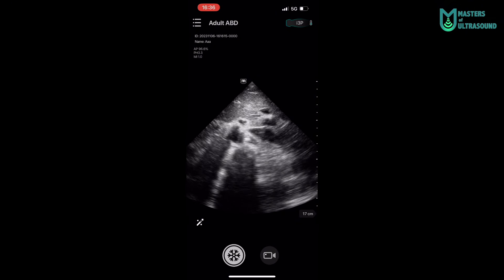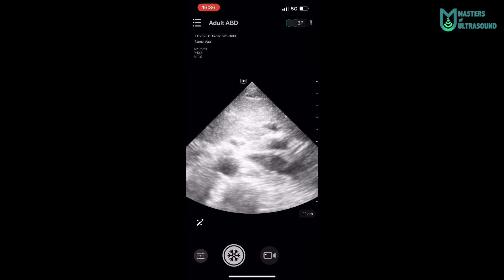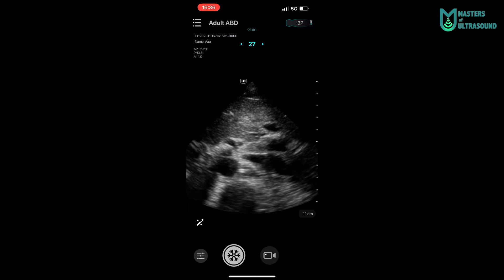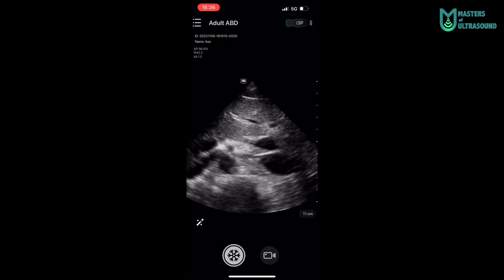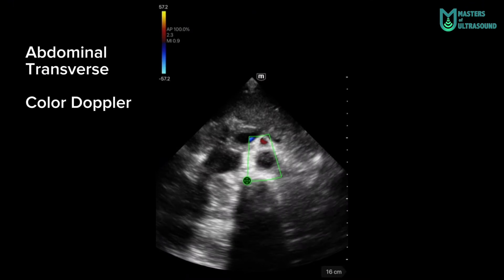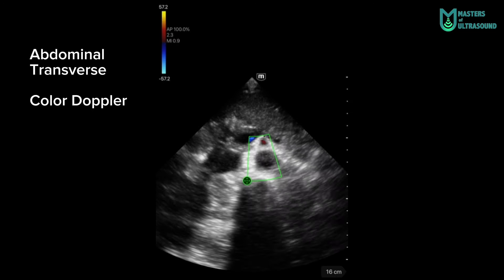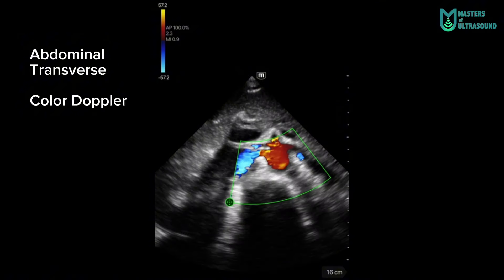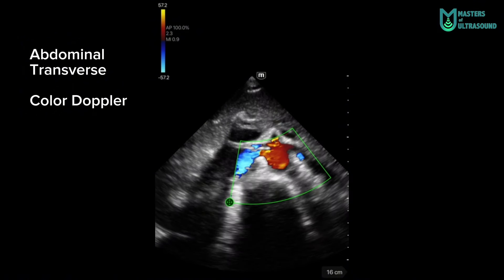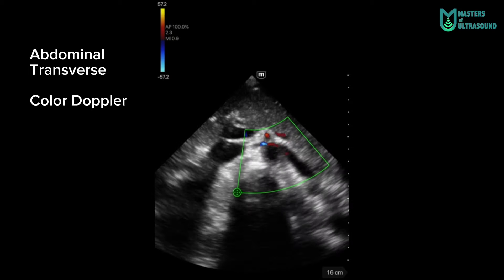Sliding the fingers up and down adjusts depth, and right and left adjusts the gain. I forgot to mention that this device doesn't have continuous doppler yet — hopefully soon. And again more abdominal transverse to see the color doppler, the superior mesenteric artery, and aorta — and here with both renal arteries emerging from the aorta and renal veins going to the inferior vena cava.